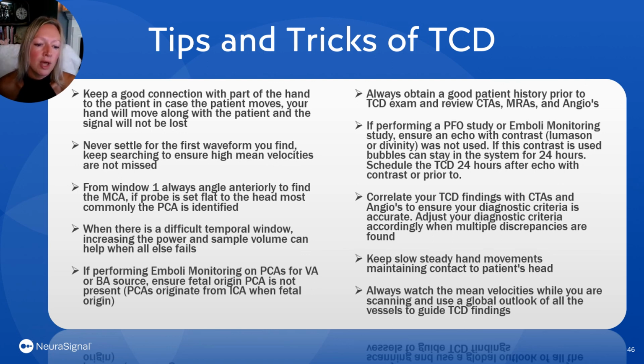When performing emboli monitoring on PCAs for vertebral and basilar source, ensure that a fetal origin PCA is not present. Always look at your patient history. Obtain a good patient history prior to the TCD exam. Review your CTAs, MRAs, and angios. If performing a PFO study or emboli monitoring study, please look to see if that patient had an echo within the prior 24 hours. There are contrast solutions called Lumason and Definity that can appear as bubbles on our TCD, and this can interfere with our diagnosis.